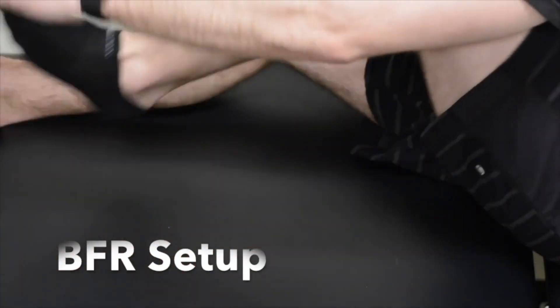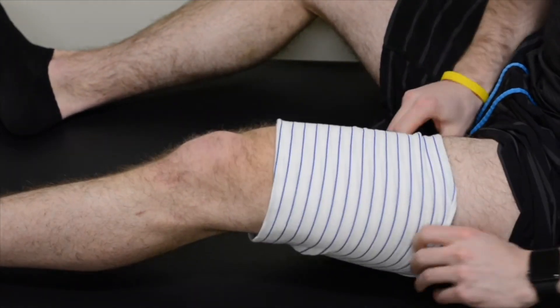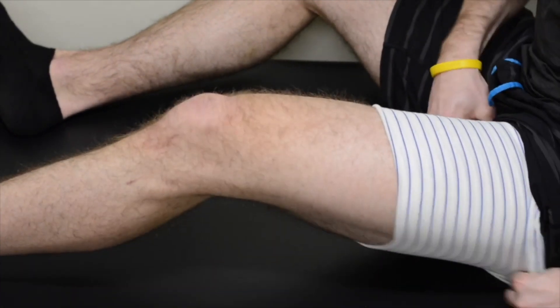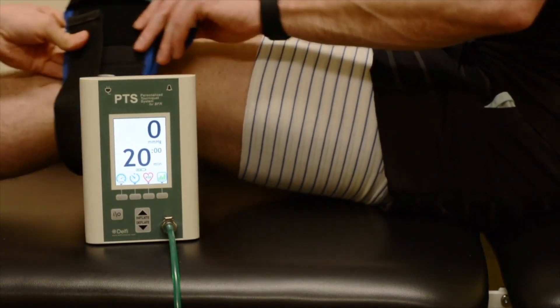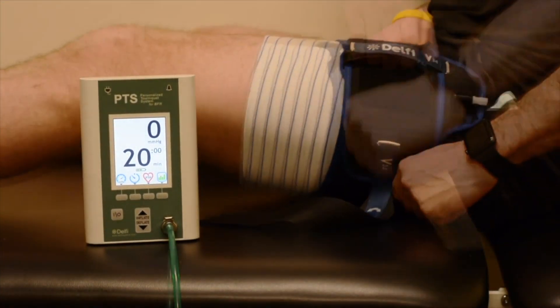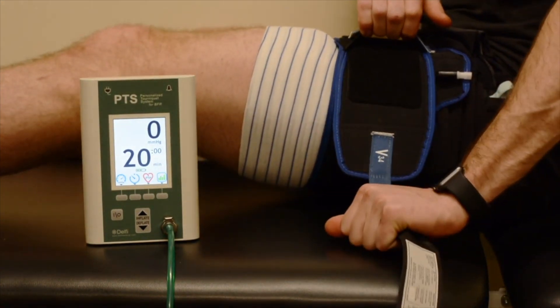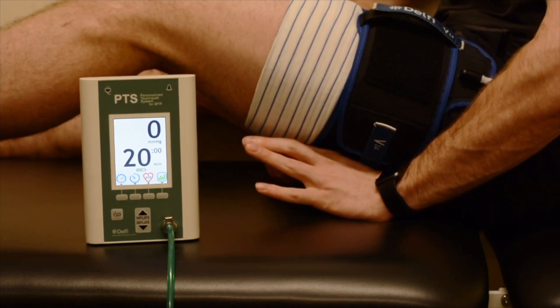Prior to cuff application, a sleeve should be pulled over the area to help protect from wrinkling, pinching, or shearing of the skin and soft tissues. The cuff may then be slid onto the thigh and over the sleeve. The cuff should reside in the proximal third of the thigh and should be secured tight enough so that only two finger widths can penetrate the cuff-to-thigh interface.